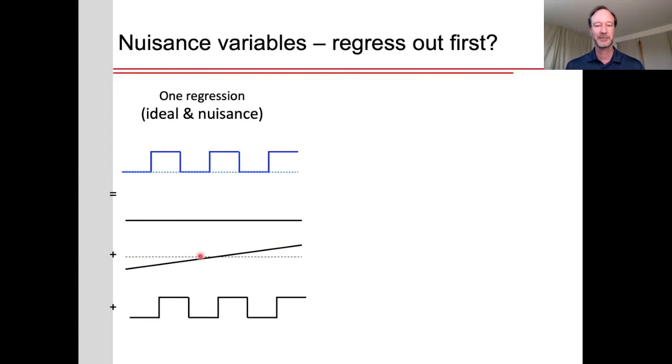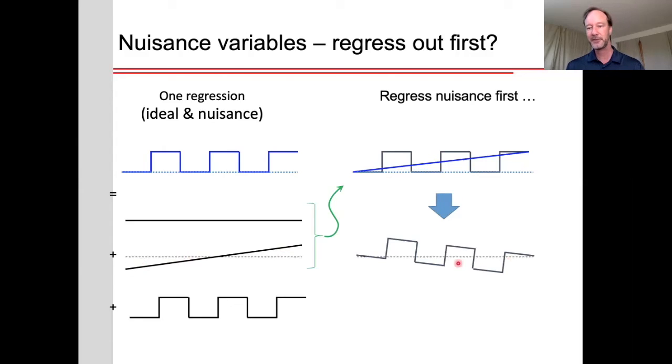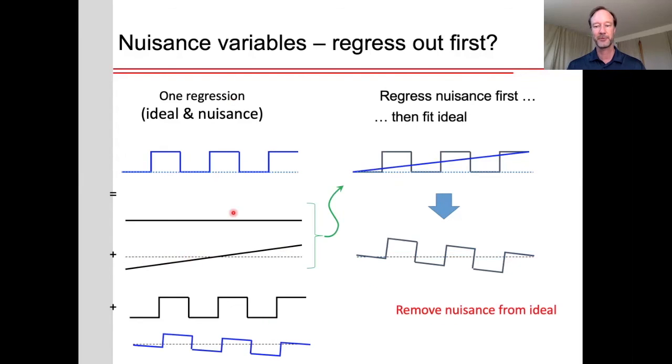However, one suggestion might be, well, let's detrend the data first. Let's remove these nuisance regressors. If we do that to this particular time course, you might notice that the linear trend would actually fit somewhat to this data. And if we remove that, we're actually distorting the effect of interest. Now, if we were to fit our ideal regressor to this time course, we're not going to get a very good fit. So if we do want to regress all of these nuisance variables out first, what we then also have to do is remove the nuisance from the ideal and then fit that to the data, and then we would get a good fit.